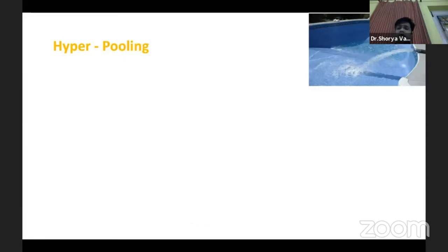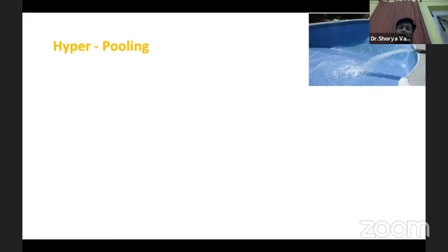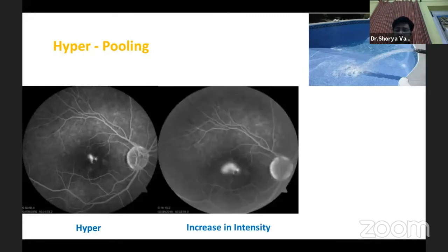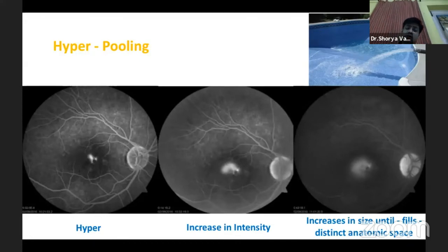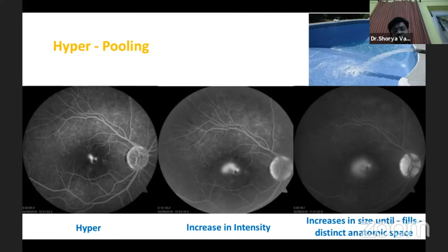The next type is pooling, which is like filling of an anatomic space. There is an increase in size and fluorescence up to the point where it fills that anatomic space, after which there is no further increase in size. As you can see, there is hyperfluorescence that increases in intensity and size until it fills that distinct space. This is most commonly seen in CSR and PED, where it fills either the neurosensory detachment or the pigment epithelial detachment.